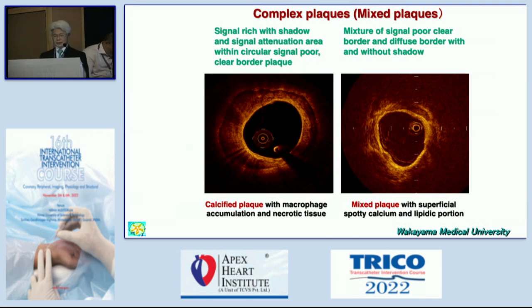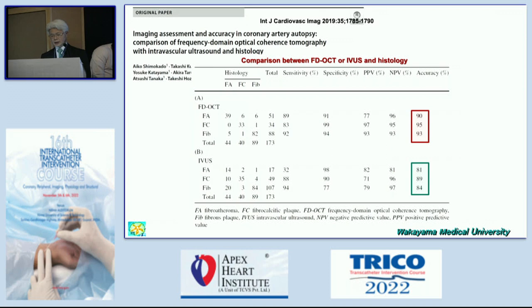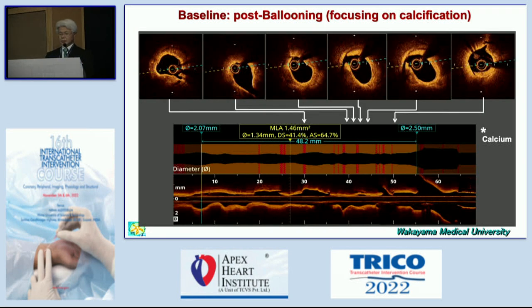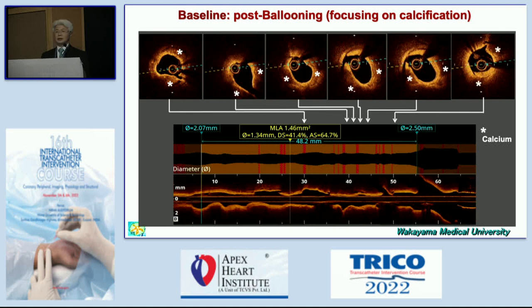OCT is much easier than IVUS, and our recent data shows that accuracy of diagnosis is much better by OCT compared with IVUS. Going back to the initial image, you can identify lots of complexity and some dissection after pre-dilatation, with calcium here and here — lots of calcium in this case. However, each calcium angle is very narrow, and we have lots of fibrous portions. Therefore, we can dilate further with a high-pressure non-compliant balloon and put a stent without any issue.